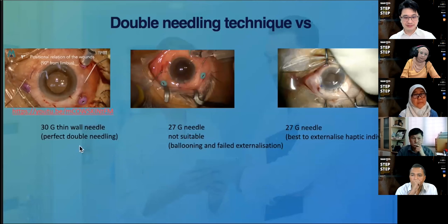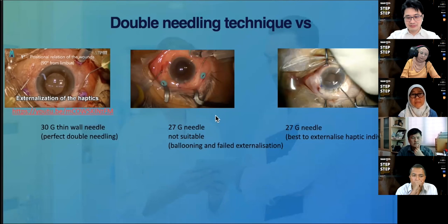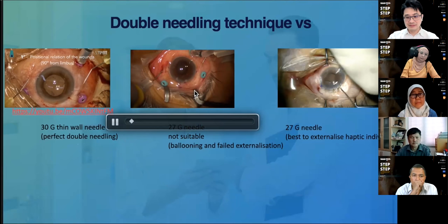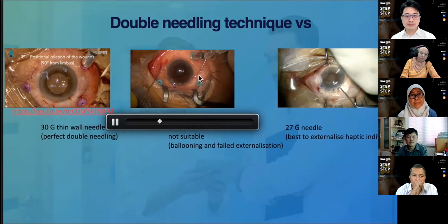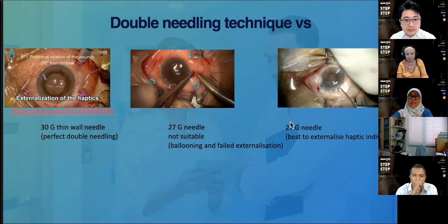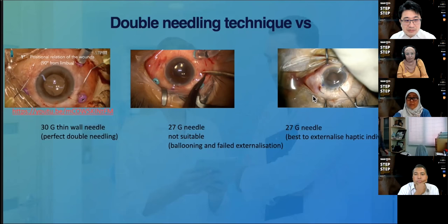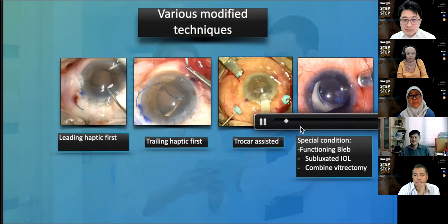This is a double needling technique. The surgeon was using the 30 gauge needle, engaging both haptics at the same time and externalizing them concurrently. We were using a 27 gauge needle, trying to simulate the same technique. We attempted it a couple of times and we ended up getting the same problem over and over again. Either we lose one end of the haptic, or we end up having a bit of ballooning of the conjunctiva, and end up having to dissect the conjunctiva to access the haptic underneath. So, in conclusion, we think that if you are using the 27 gauge needle, it's probably not the optimum needle to use for this particular technique. Probably the best way is to externalize the haptic individually rather than the double needling technique for the 27 gauge needle.